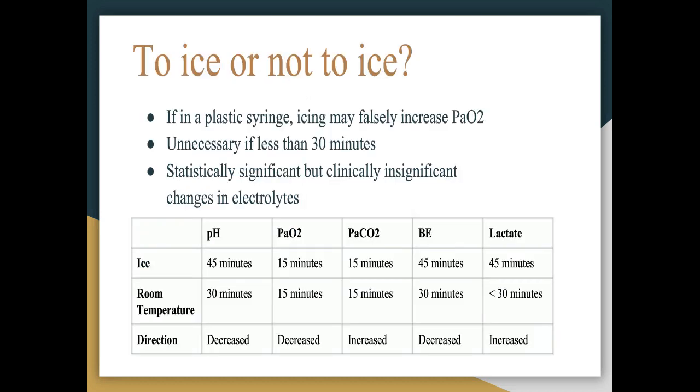Whether to ice or not is one of the biggest debates in medicine regarding arterial blood gases. As we discussed previously, if the sample is in a plastic syringe, icing may falsely increase your PaO2. Indeed, icing is probably unnecessary if the sample is analyzed within 30 minutes. As you can see from the chart below, icing may be indicated depending on the time course of the sample.